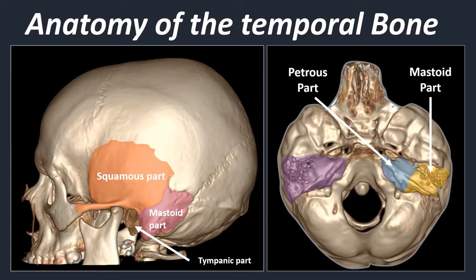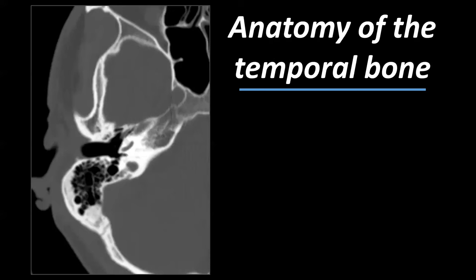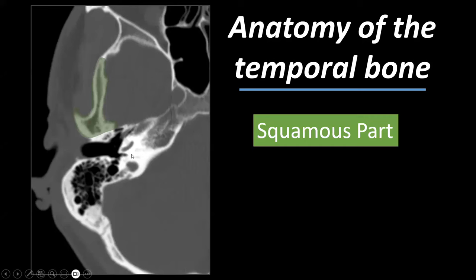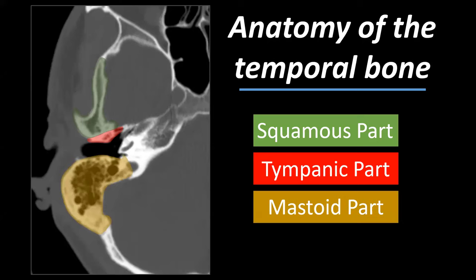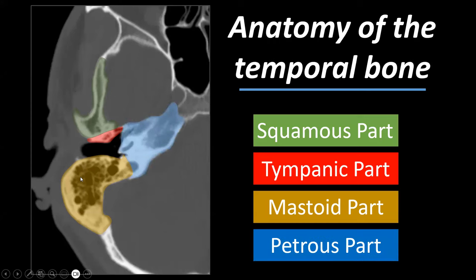Looking at axial CT images in bone window, we can identify the squamous part, the tympanic part which constitutes the bony wall of the external auditory canal, the mastoid part with many small mastoid air cells, and the very dense petrous part — triangular or pyramid-shaped — which articulates with the clivus and contains the cochlea, the semicircular canals, and the vestibule.